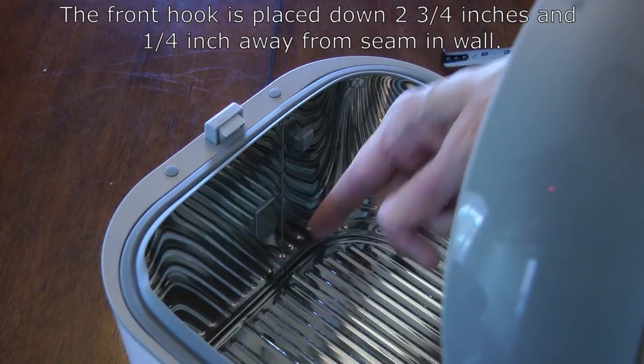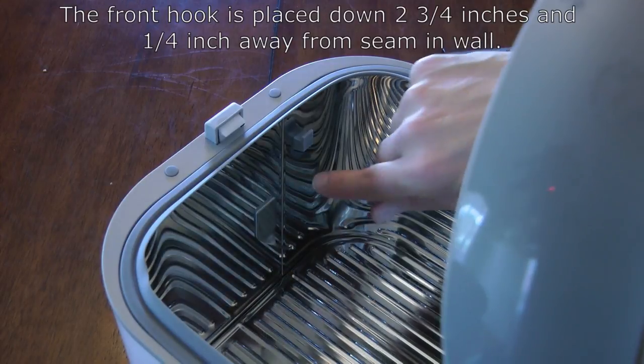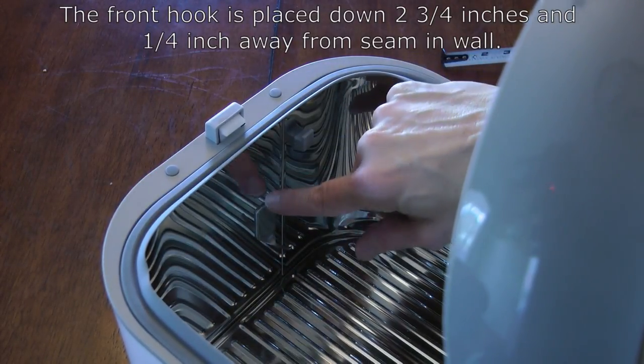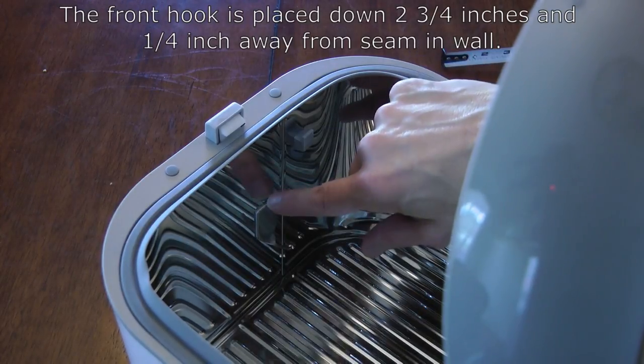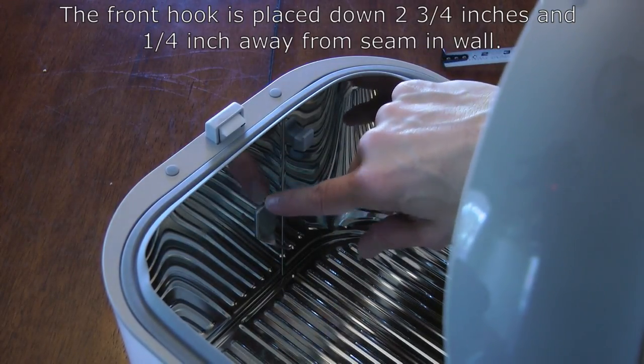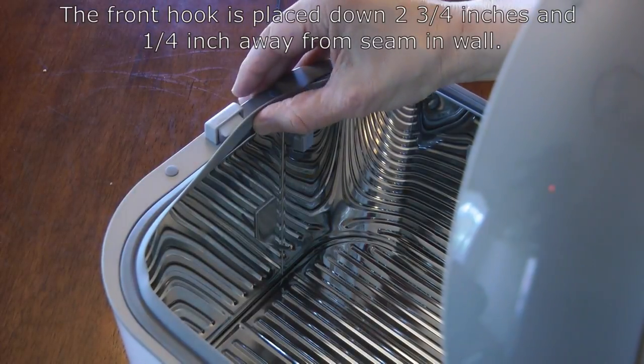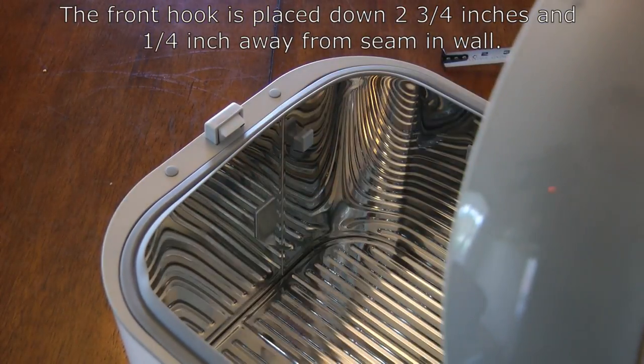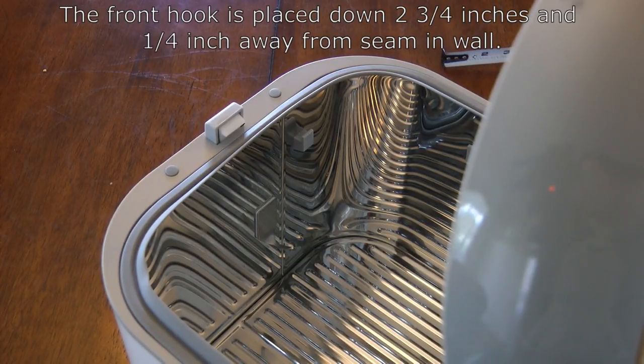That distance isn't super critical but around a quarter inch is good. The depth is roughly two and three quarters — maybe just a hair more, two and seven eighths — somewhere in that area of two and three quarter inches down from the lip of the chamber to the top of the metal hook. There's some margin of error on this hook; if you're off by a little bit it just changes how the basket is supported at the front and you won't notice much difference.